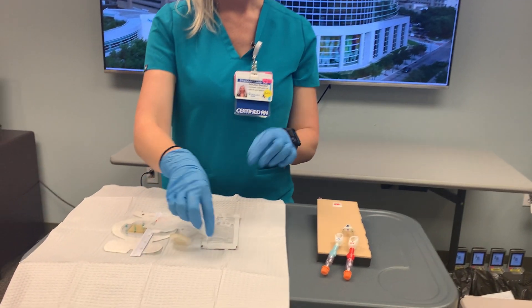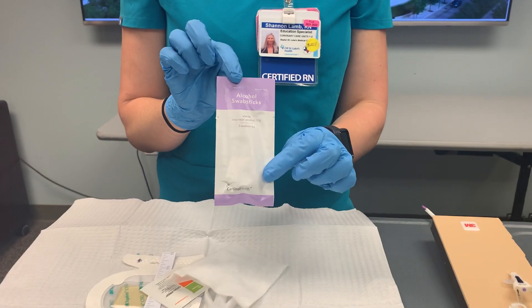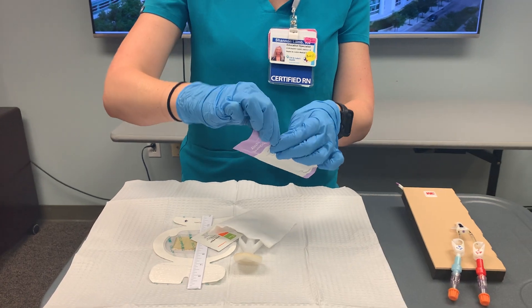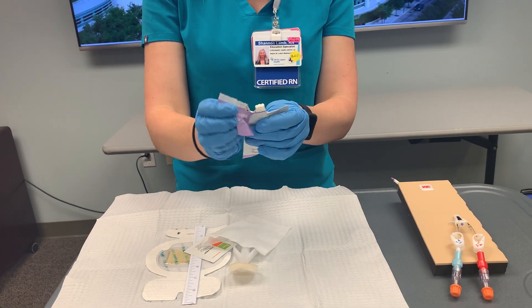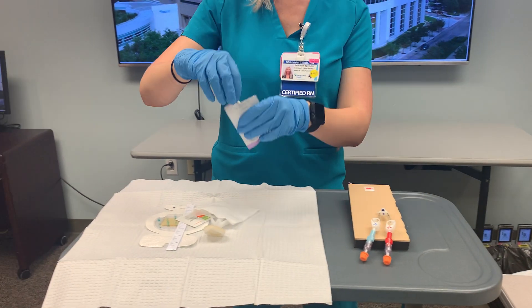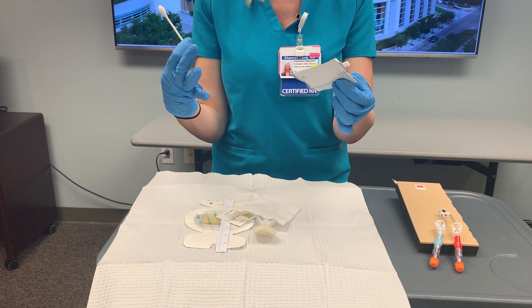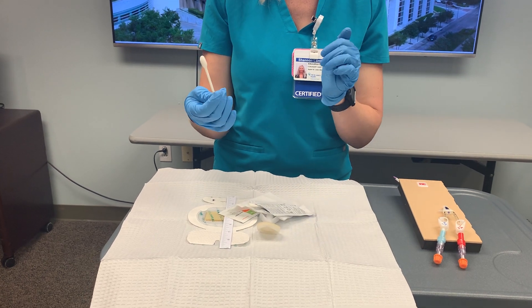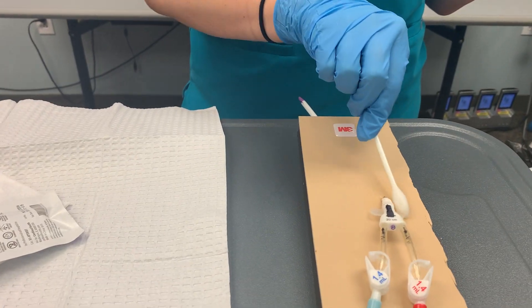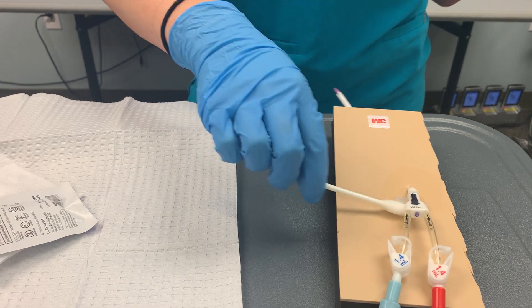Our first step is to locate our alcohol swabs. The alcohol swabs will be used to remove any debris from the patient's dressing area prior to using the chlorhexidine. We'll open up our alcohol pack, throw any extra things in the trash, and then pull out our first swab stick. I'm going to start by cleaning around the insertion site, maintaining a wet contact time with the alcohol of at least 15 seconds.